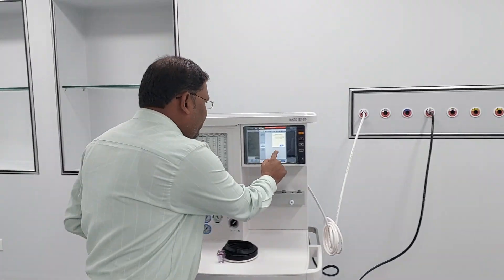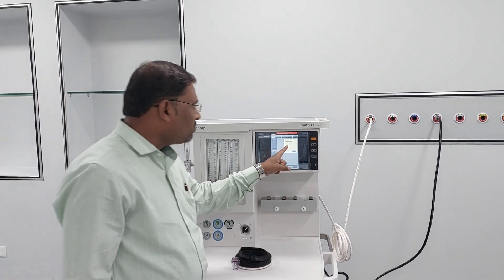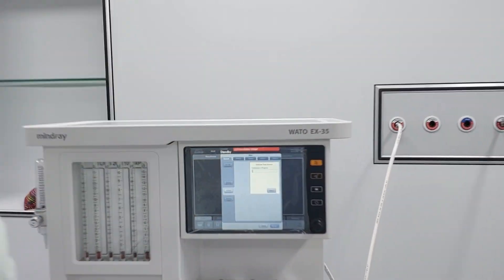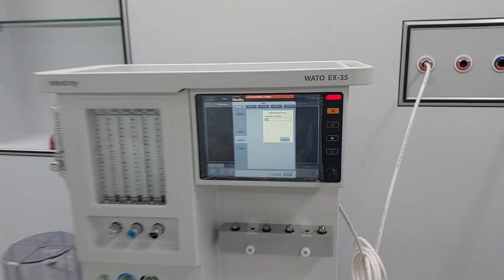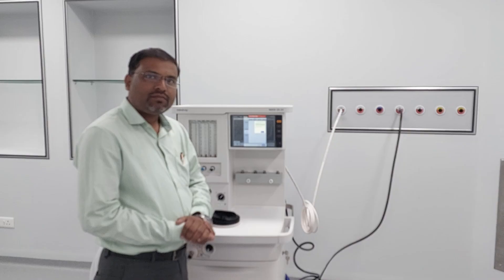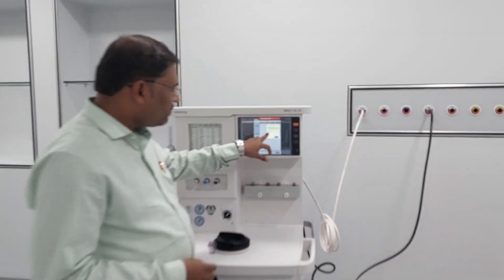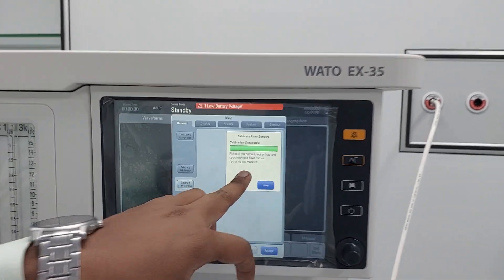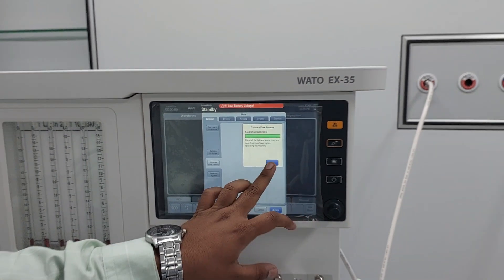Then press 'Begin'. For some time you can observe 'Calibration in Progress'. It takes approximately one minute. Now you can see — Calibration Successful! Reinstall the bellows, water track, and open fresh gas flows before operating the machine.